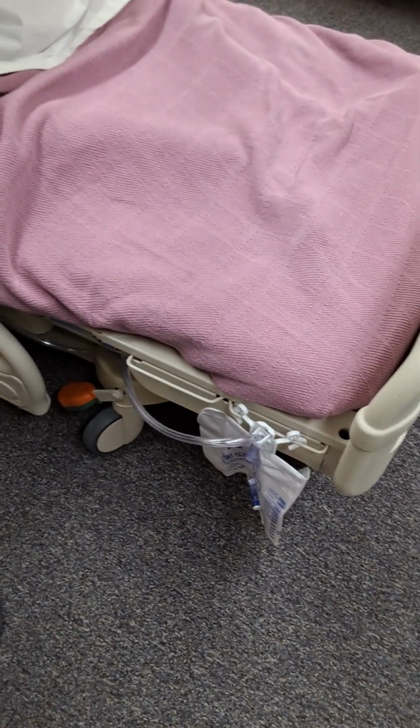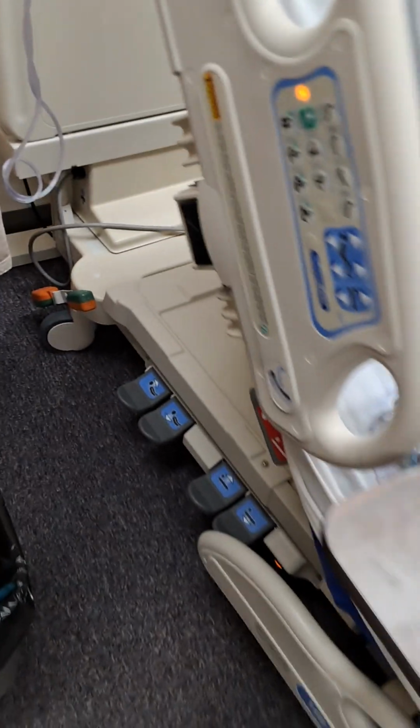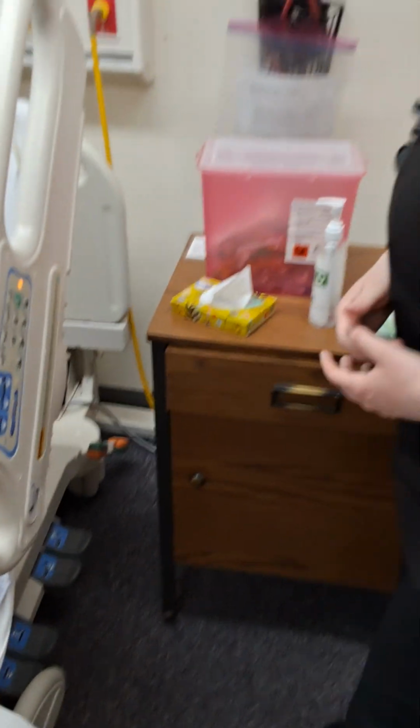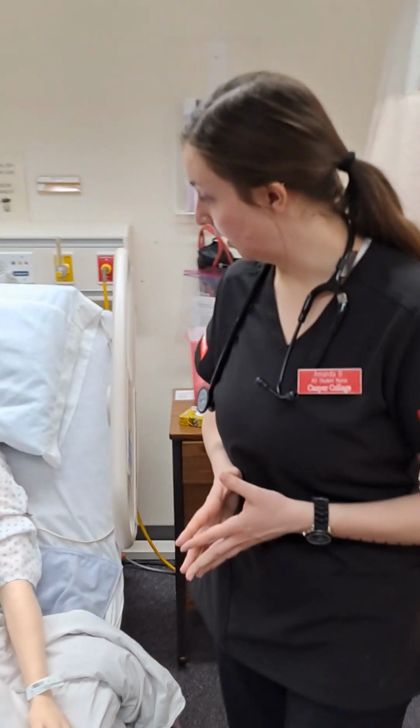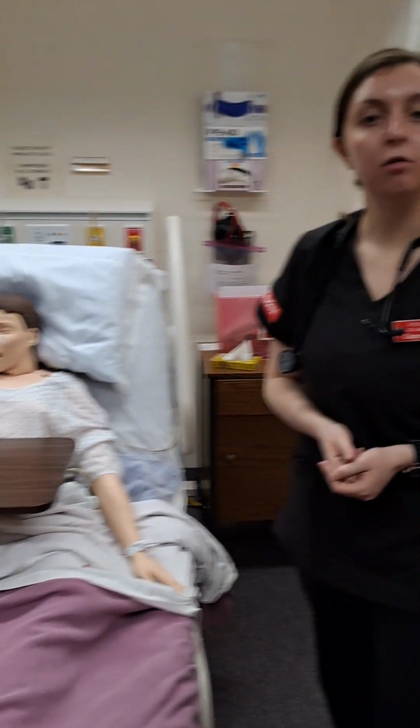So that one is on. That one is on as well. Okay, I'm going to check the other side. This one is on. And I'm going to put my foot on that one. And that is on. Okay. Do you need anything else? No? Okay. I'm now going to document the insertion and my skills complete.